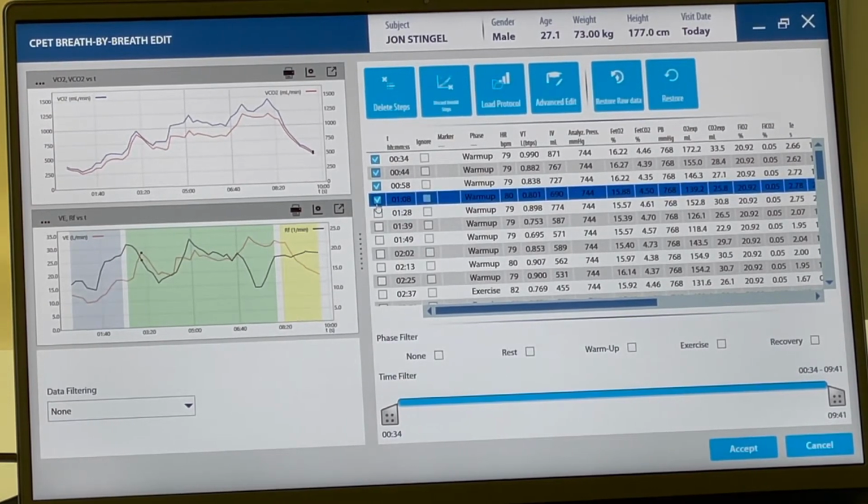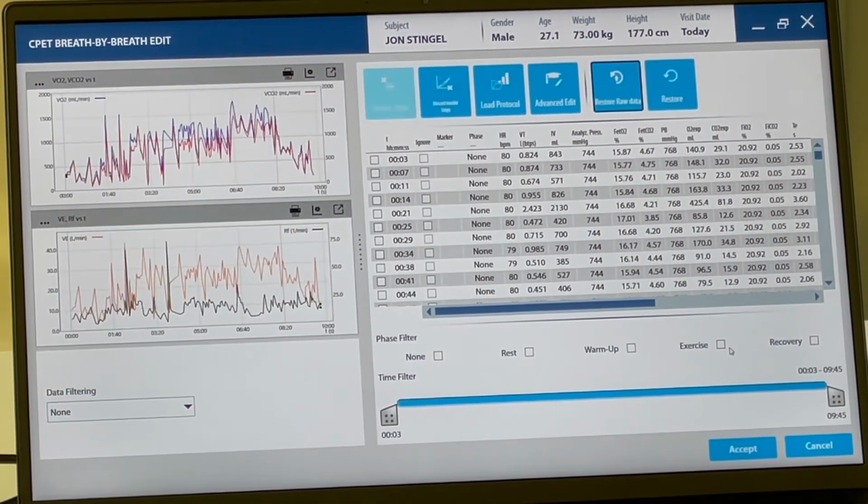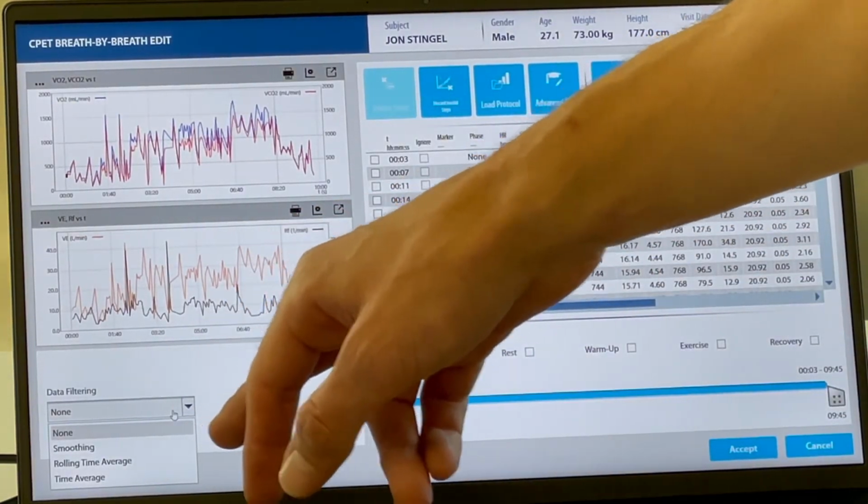Okay. Could you show the other time averaging? Yeah, they're all raw, and you do your own manipulation in Excel, because you're not going to be able to tell the software how to get around that. But all your filtering will just be right here.